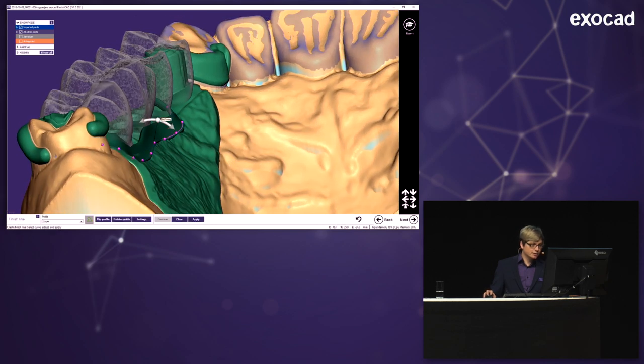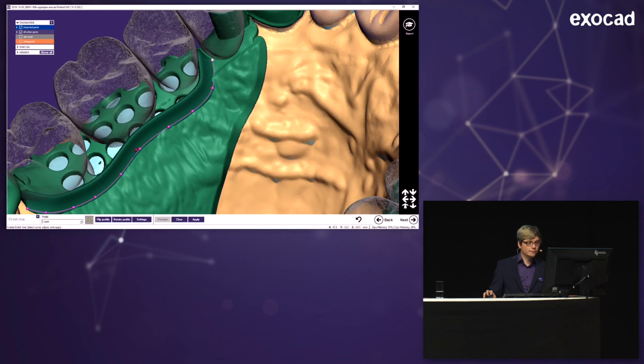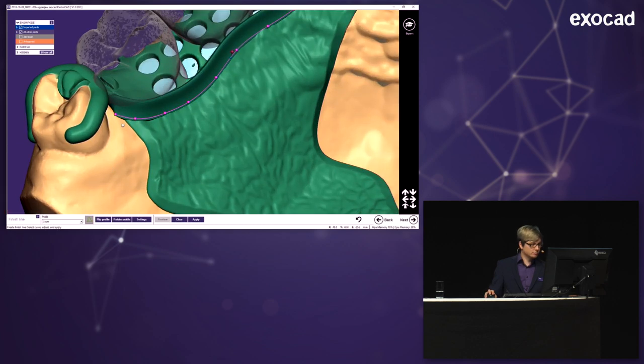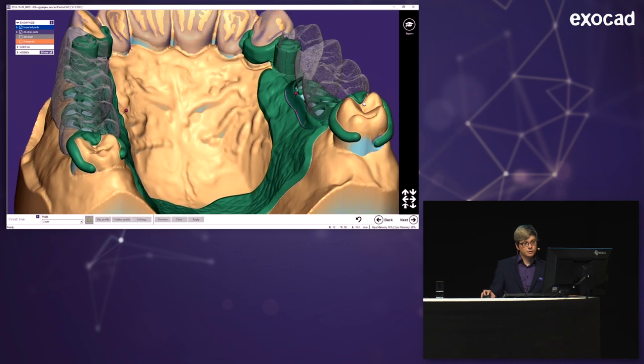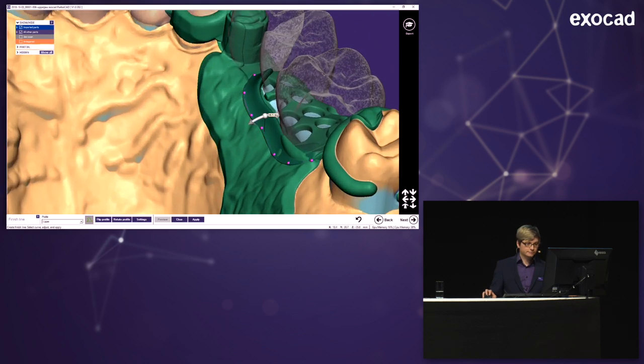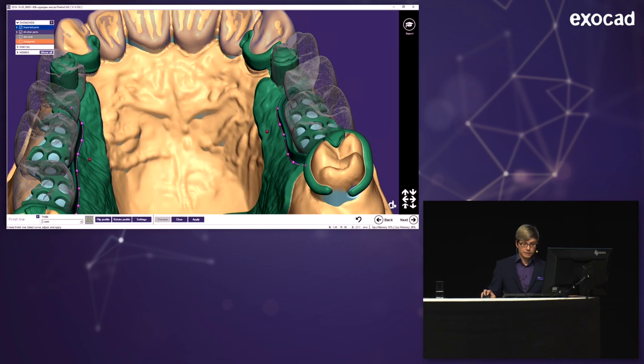They're a little bit conical here, and I can just take them and change the degrees. And they're changing live. You can also start changing the drawn finish line here. The design switches right at this moment. So I think this is good for this side. On the other side, a quick look. Okay. So I'm pulling this out a little bit. But I think I'm happy with the design, yeah. OK, then on to the next step again.